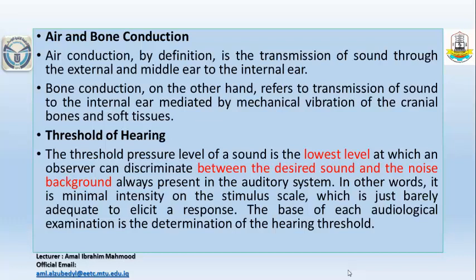So, among the noise, you can recognize a lowest level. This is called the threshold, always present in the auditory system. In other words, it is the minimal intensity on the stimulus scale that is just barely adequate to elicit a response. The base of each audiological examination is the determination of the hearing threshold.